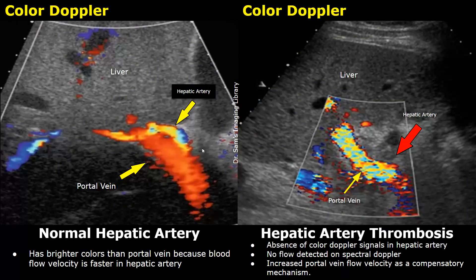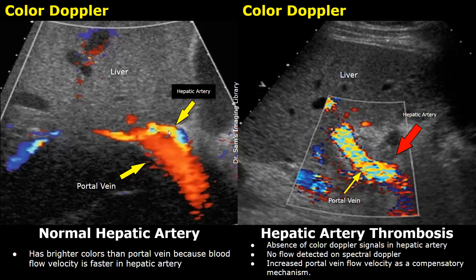In the image on the left, color Doppler is applied at the porta hepatis, where we can see the portal vein and the hepatic artery. The larger vessel filled with red color is the portal vein. The smaller vessel next to the portal vein, with brighter colors, is the hepatic artery. The hepatic artery has brighter colors because blood flow velocity is much higher in the hepatic artery than in the portal vein. This is how we can find the hepatic artery and distinguish it from the portal vein.